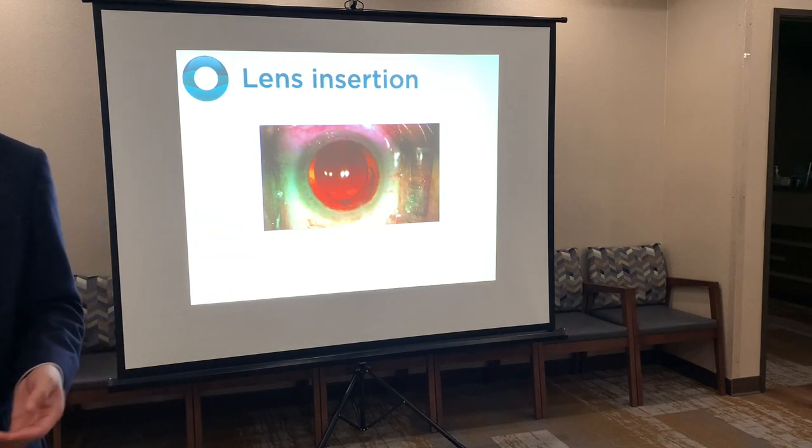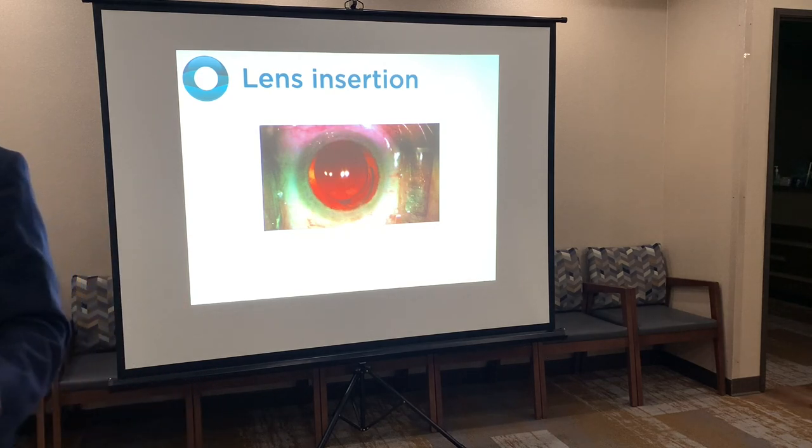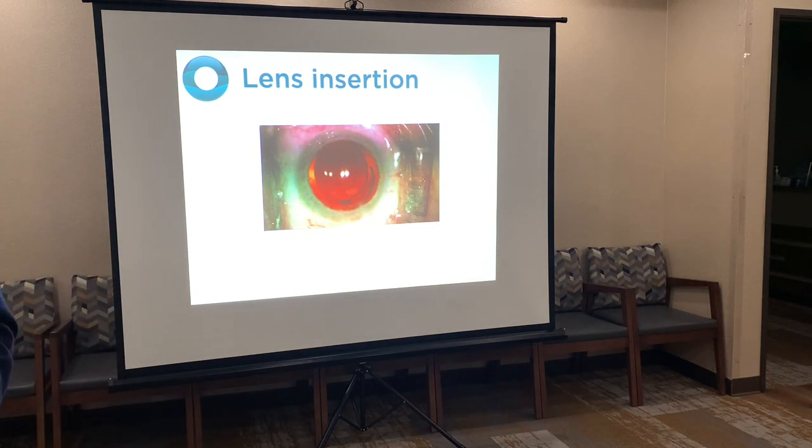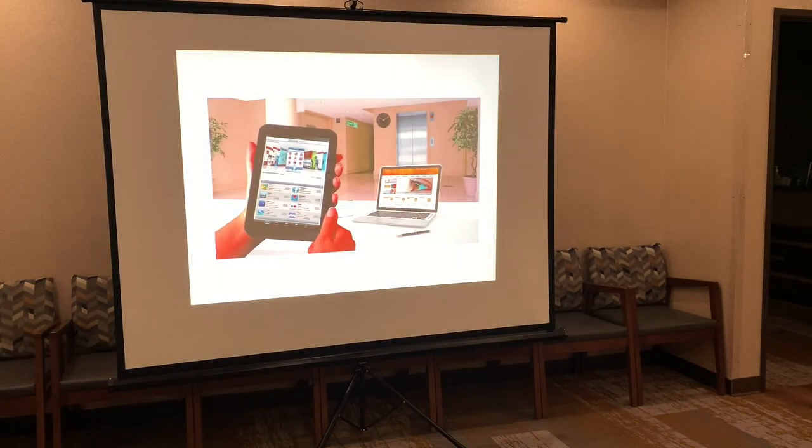It slows down the patient's recovery. They have to spend two to three more weeks on the eye drops that they would not have had to do if the lens didn't rotate. So hopefully that helps answer that question.